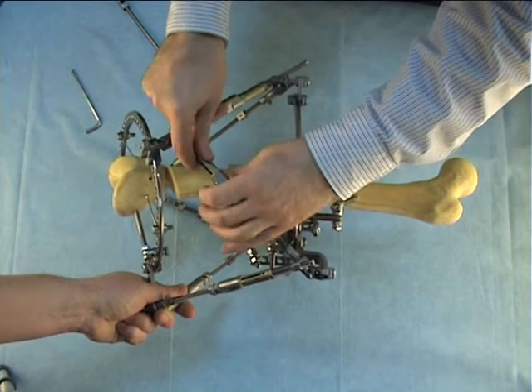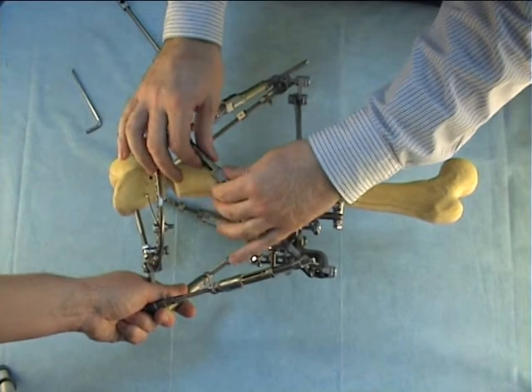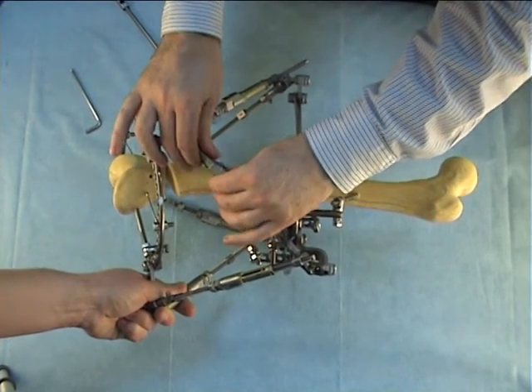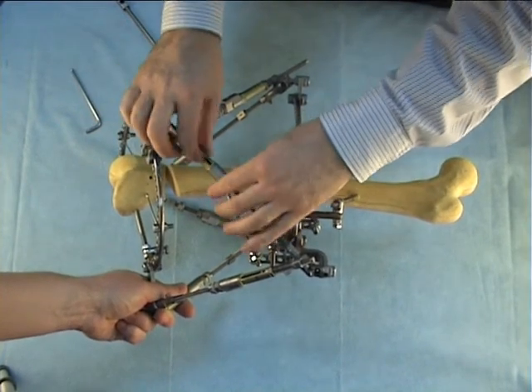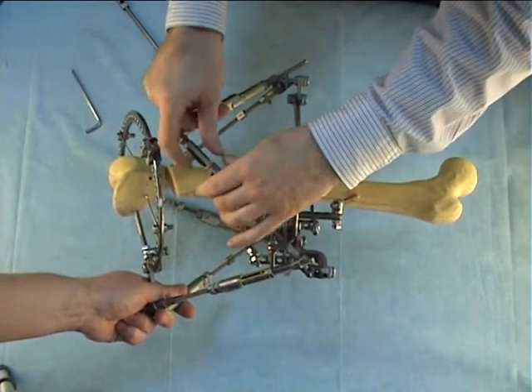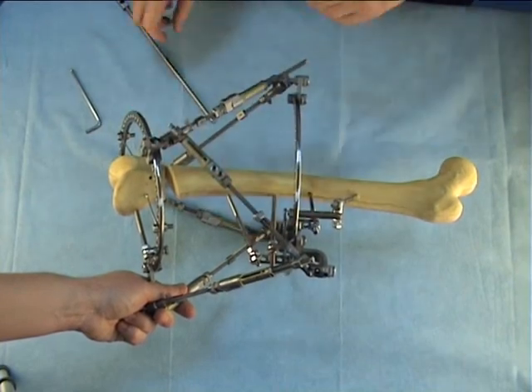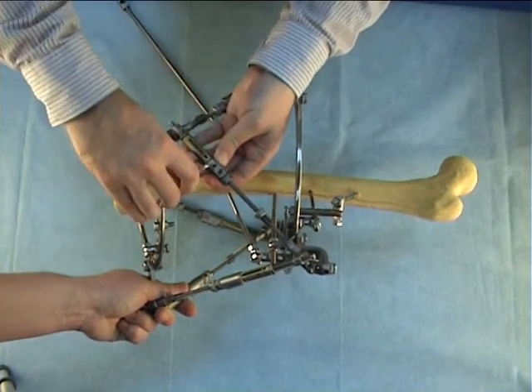The motions by the right and the left hand must be equal. In this case, we make a transfer of the yellow body along the internal threaded clutch and along the threaded rod, and the strut length while doing this should remain the same. You see how it is made — the length remains the same. No motion of bone fragments while doing this procedure.